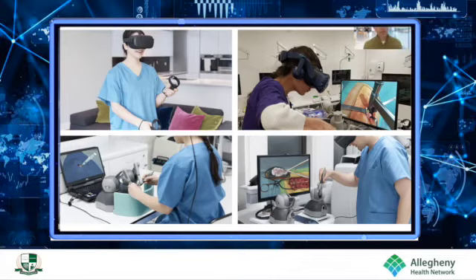How well does it train surgeons? Well, the top left-hand one is great at doing procedures, procedural awareness, so getting used to the steps and the tools, etc. But if you want to build the skill, then you're going to need the haptics that you see as part of the bottom two images and the one on the right, because that's when you start to be able to understand how it feels to do it right or to do it wrong, to push too far, to plunge through when you're starting to drill, or to over-ream something, or to resect it in the wrong way. You can feel that with the other areas. And when you've got that combination of immersion through VR and the kinesthetic haptics that come from the things you see in the bottom, then you start to get real skills transfer.